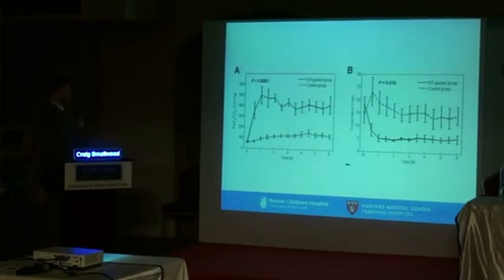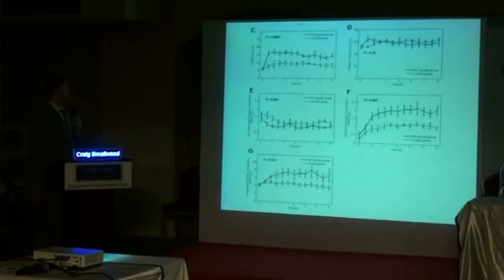And consequently, if we just look at oxygenation index, which I think is a more true representation of oxygenation in neonates and children, we see a similar finding. This is why it made a difference. Obviously, the PEEPs had to be different. That was the chief thing that we're changing during ventilation. And you can see right from hour 0, so the first 30-minute window, we're just on higher PEEP. And that's what the EIT device was telling us that ARDSNet wasn't telling us. ARDSNet was just totally satisfied to be on a relatively reasonable FiO2 and a lowish PEEP value.